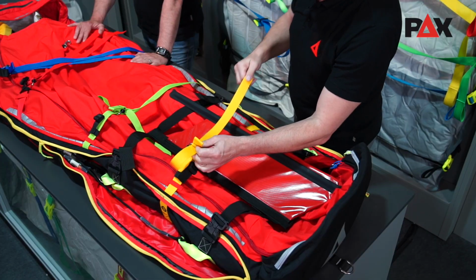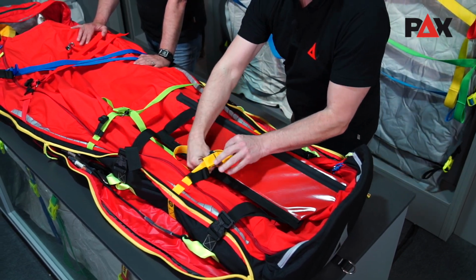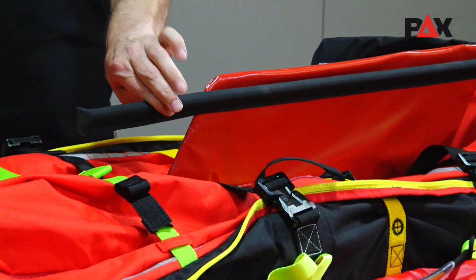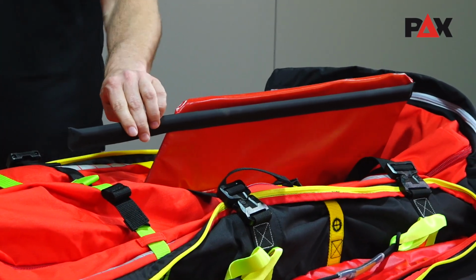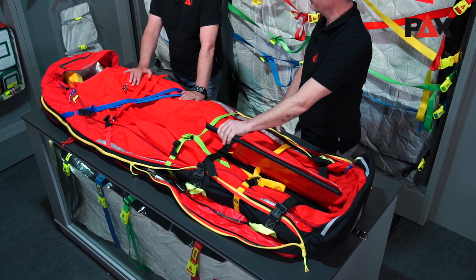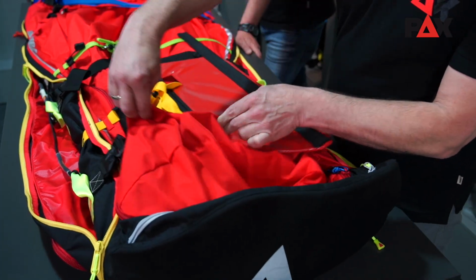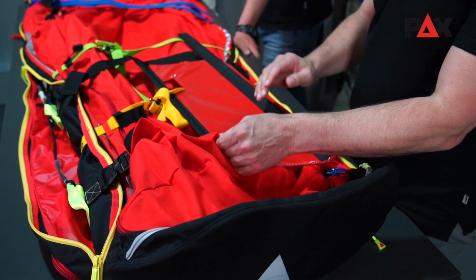For third level security, we use the yellow compression strap for securing the anti-rotation device. By using this handle, the operator just operates, of course, the anti-rotation device against the rotating direction of the bag to have it stable under the helicopter. To avoid the blow-up of the rescue bag, we have some holes at the end so that the incoming air just can go through and no blow-up will happen.